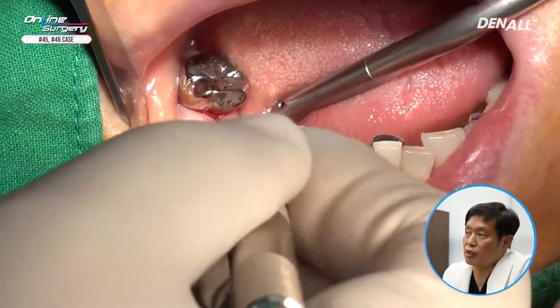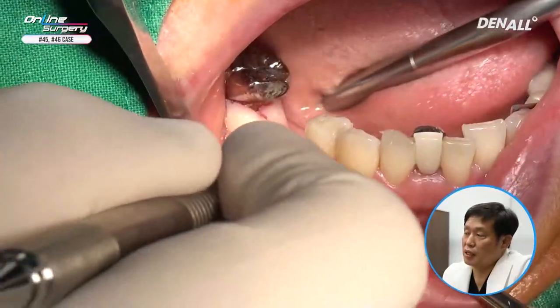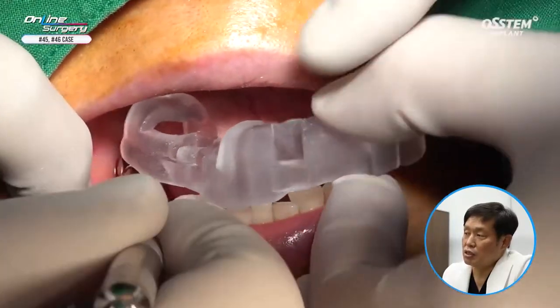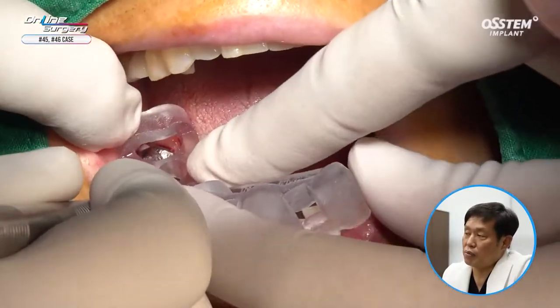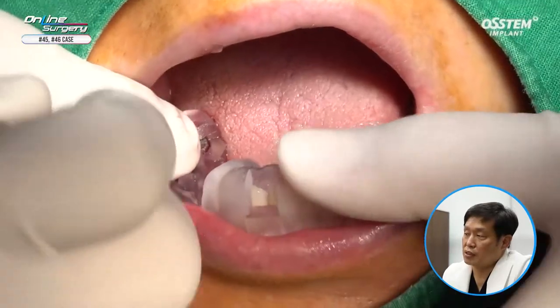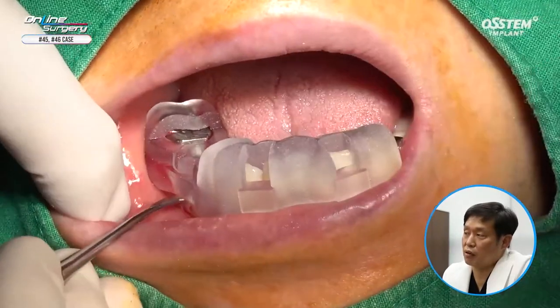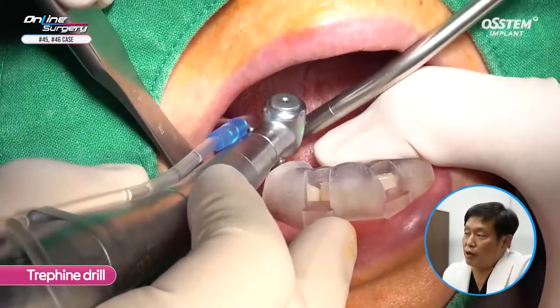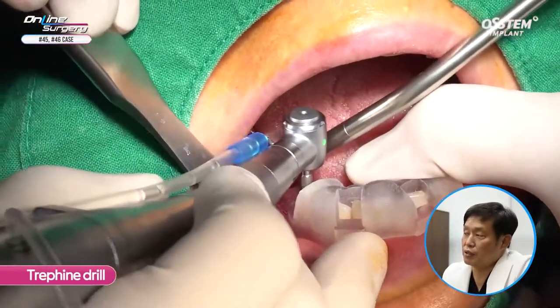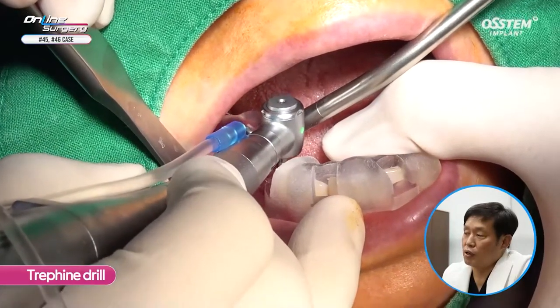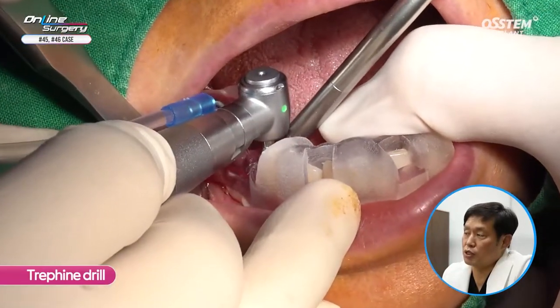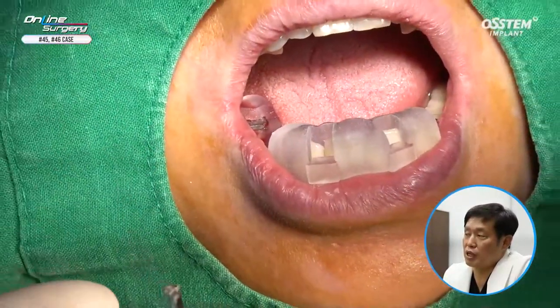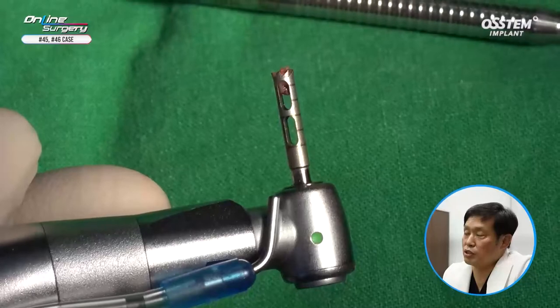Surgery was performed. Without using a tissue punch, because GBR was planned, the flap was reflected just enough for the drill to go in. The guide plate was adapted and confirmed in position. The trephine drill was used for biopsy to retrieve bone and assess how much bone was formed using socket preservation with AOS.